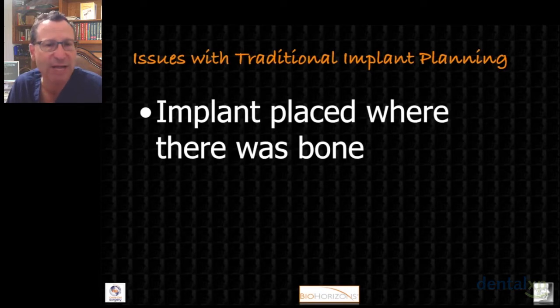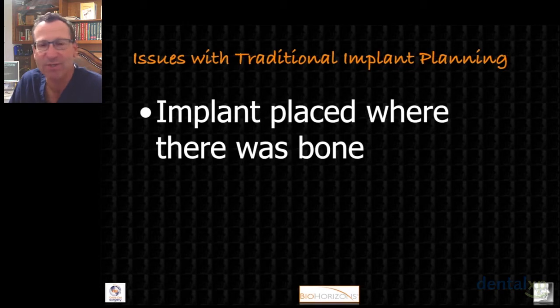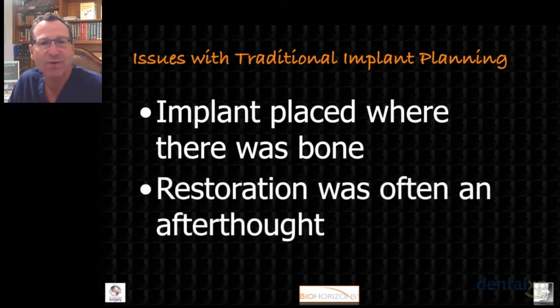We might have a surgical guide made that told us right where the center of the final prosthesis was going to be, the occlusal table, and we had our pilot drill through the pontic in the surgical guide. And when we flapped it open, we would see that the bone was not where we thought it was. It was a little bit more to the lingual or the palatal. And so we'd have to move our implant clinically in surgery to try to get this implant in good solid bone. And then the result was the restoration became an afterthought.